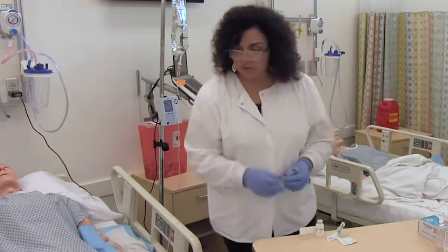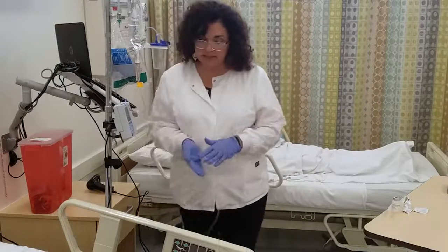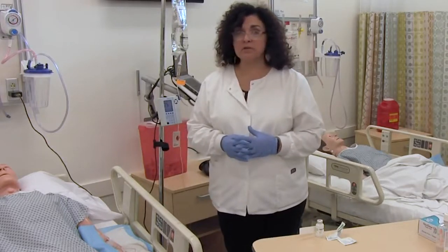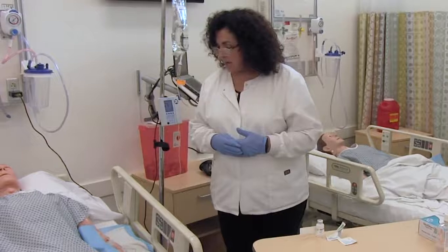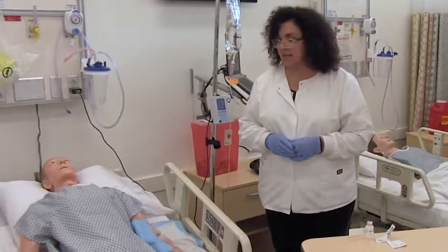At this point, we're going to get rid of our needle and syringe in the sharps container. Certainly, we're monitoring our patient very closely because, again, this is going to have an immediate effect. So we'll make sure there's no adverse effect or allergic response to this as we're giving it.